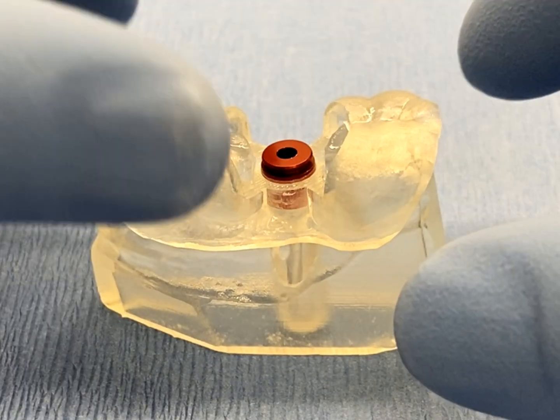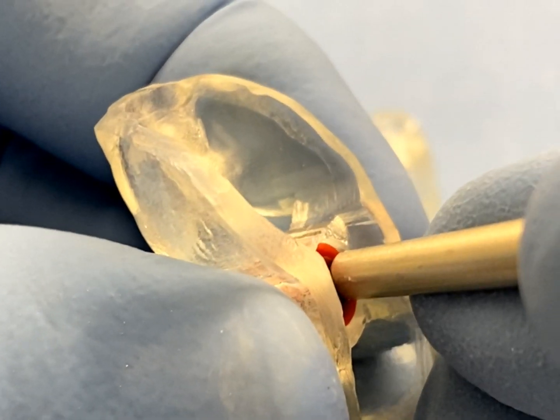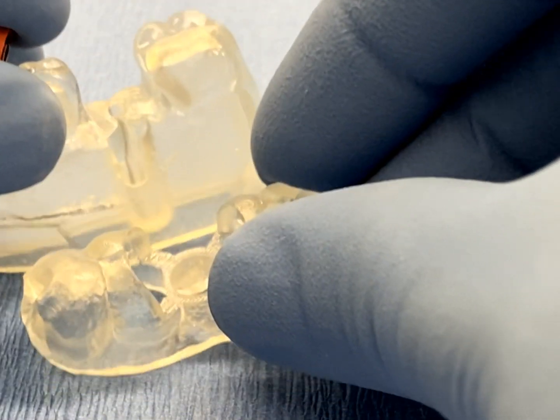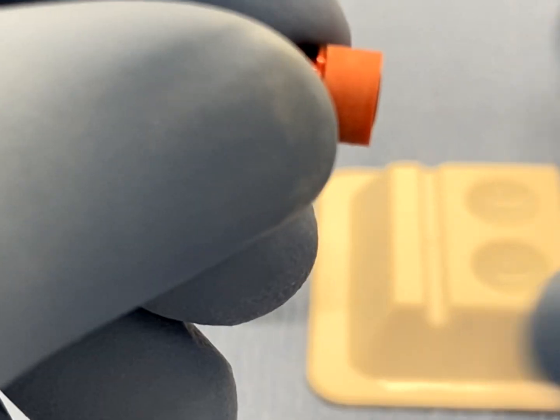After the fit has been confirmed, remove the assembled GRS surgical ring and surgical guide analog from the surgical guide by using a blunt instrument. Care should be taken not to distort the internal retention features of the surgical ring.